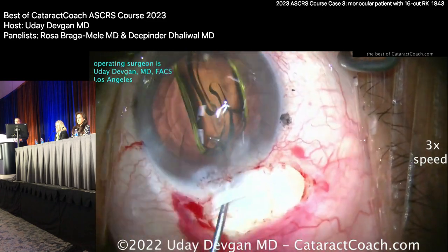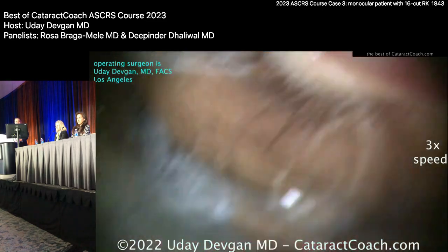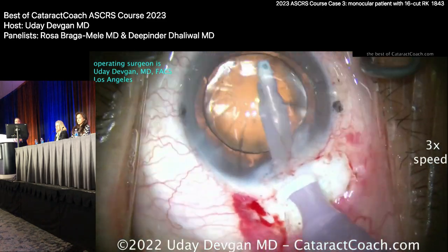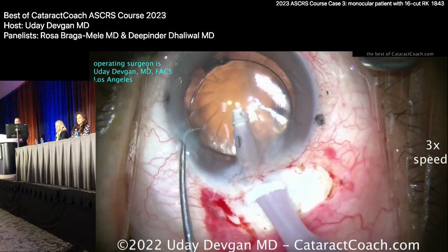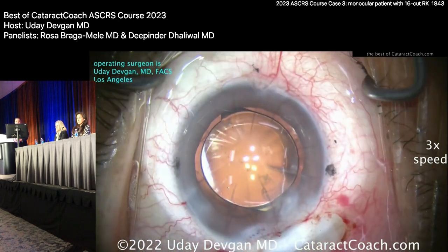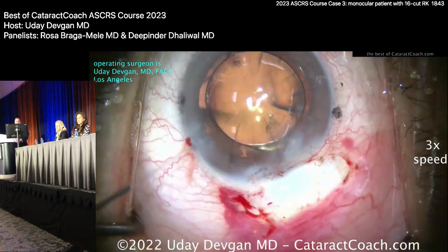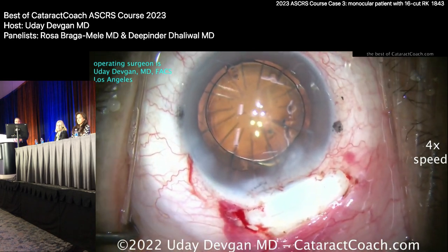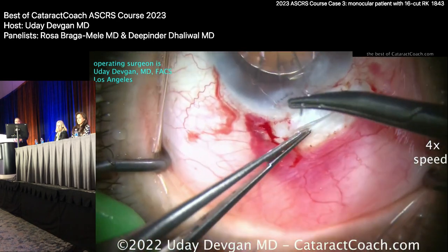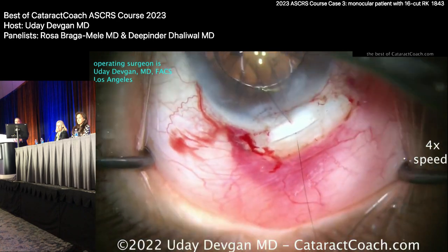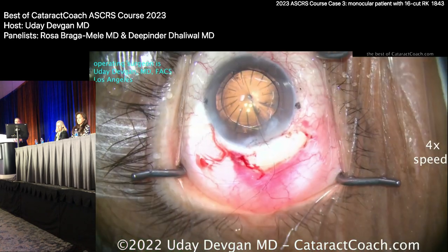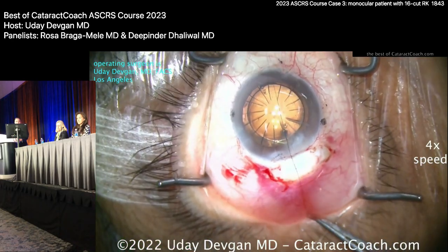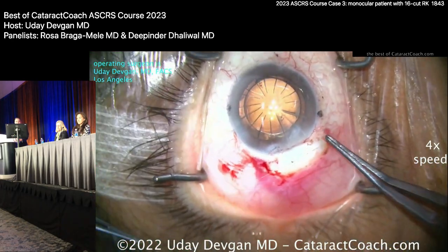Here comes the lens — it looks like a 28.5, looks like a toric lens even. Clean that up. I'm going to suture the main incision — use 10-0 nylon and suture up that main scleral incision and close the conjunctiva over it. The main challenge we're going to have here is not intraoperative — it's going to be post-op, because I shouldn't have touched those temporal vessels. Deepi told me and I didn't listen.